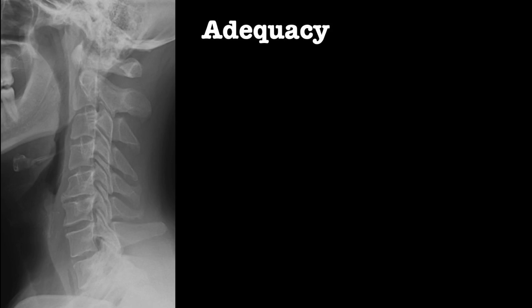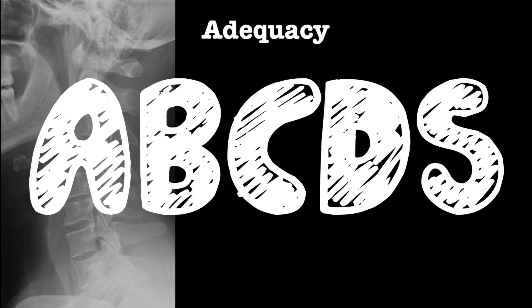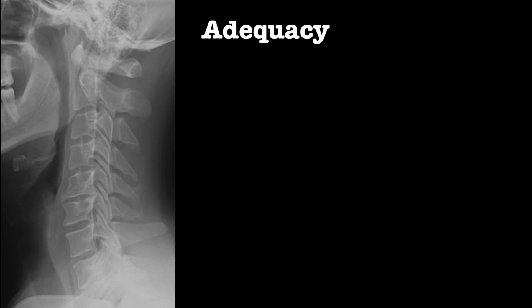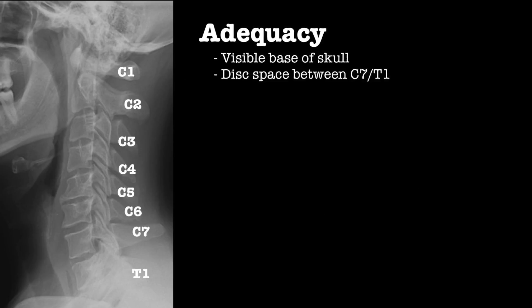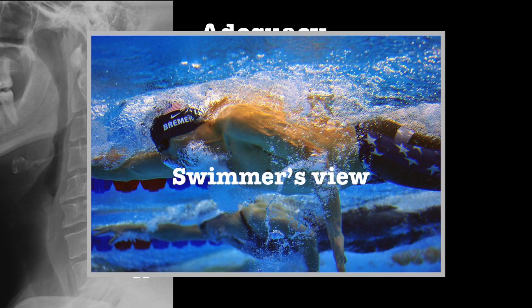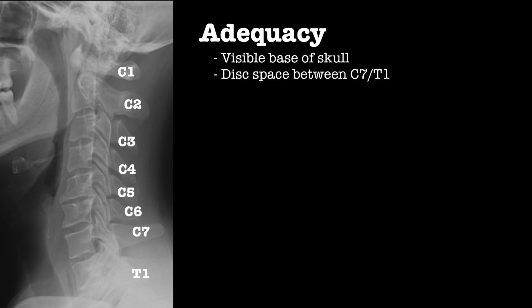On your lateral x-ray, work through your ABCDs. A is for adequacy and alignment. For adequacy: is the skull base to C7-T1 disc space visible? If not, you need to ask for a swimmer's view, where the patient is asked to lift their arm up, and this clears the humeral head of the cervicothoracic junction.